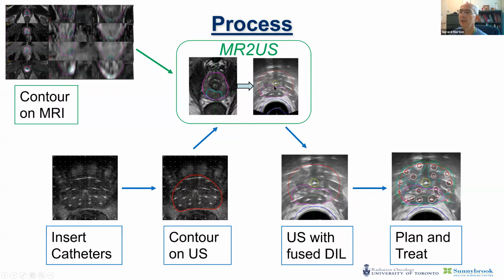Some smoothing and post-processing occurs to carve the expanded DIL away from the urethra and to stop it expanding outside the prostate if we so desire. So this is then exported back to the Oncentra Prostate planning system, which is what we use, and then planning proceeds with some extra dose constraints for the GTV. This probably adds about 5 minutes to the workflow.